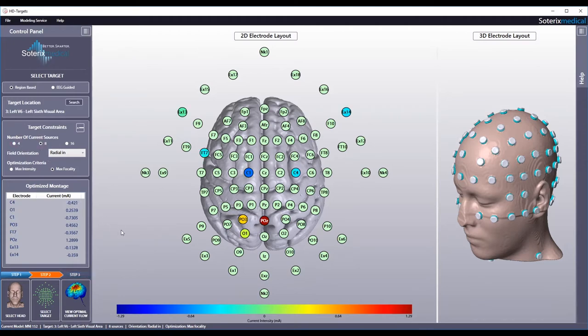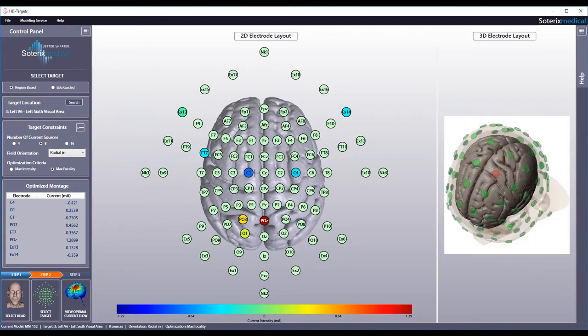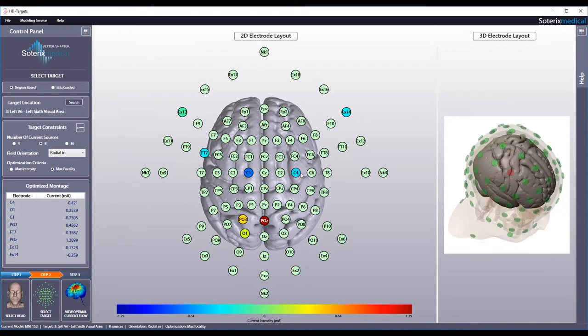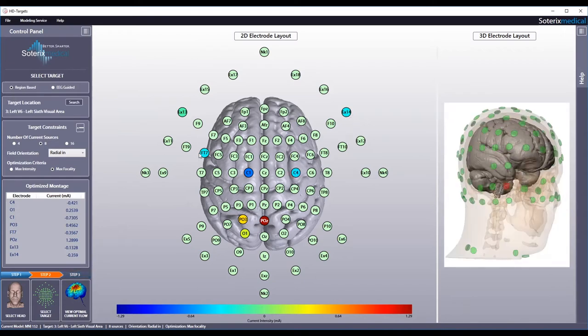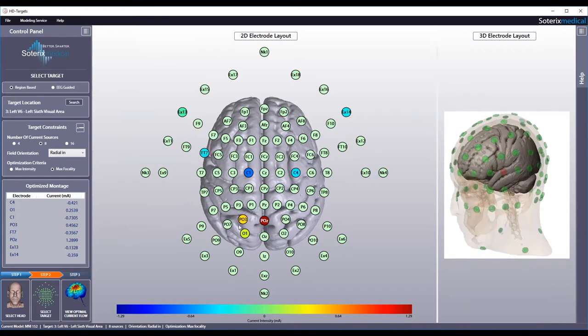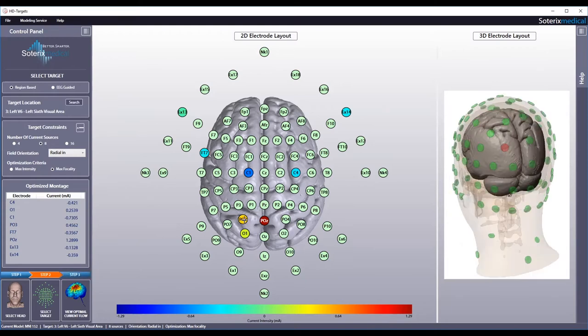To visualize where each selected electrode is located in relation to the underlying brain, you can click on the location in the 2D electrode layout and observe the corresponding 3D electrode layout. The selected electrode will be displayed in red, while the others stay green.